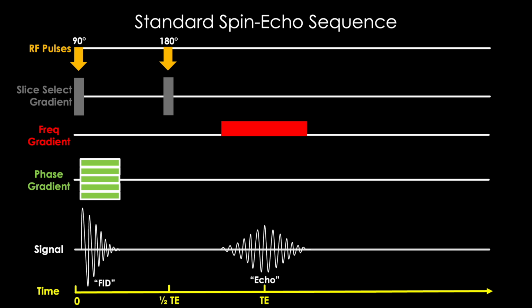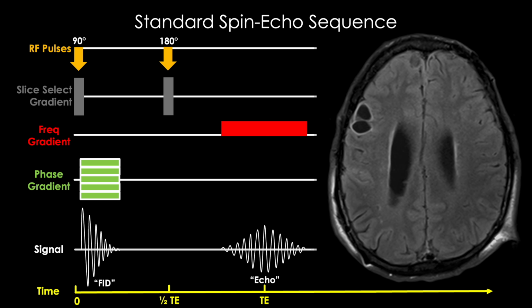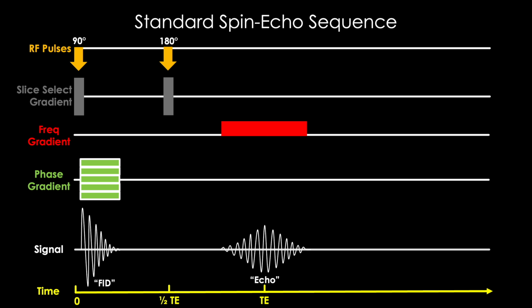This, my friends, was a huge breakthrough when developing MR imaging, and as you see, turns images that would otherwise be unreadable into ones you bet your health and life on. This is the granddaddy MRI sequence. Know it for boards, and on a side note, I don't think it's a coincidence that there's some symmetry to this process, having seen what's going on with the spins up until this point.